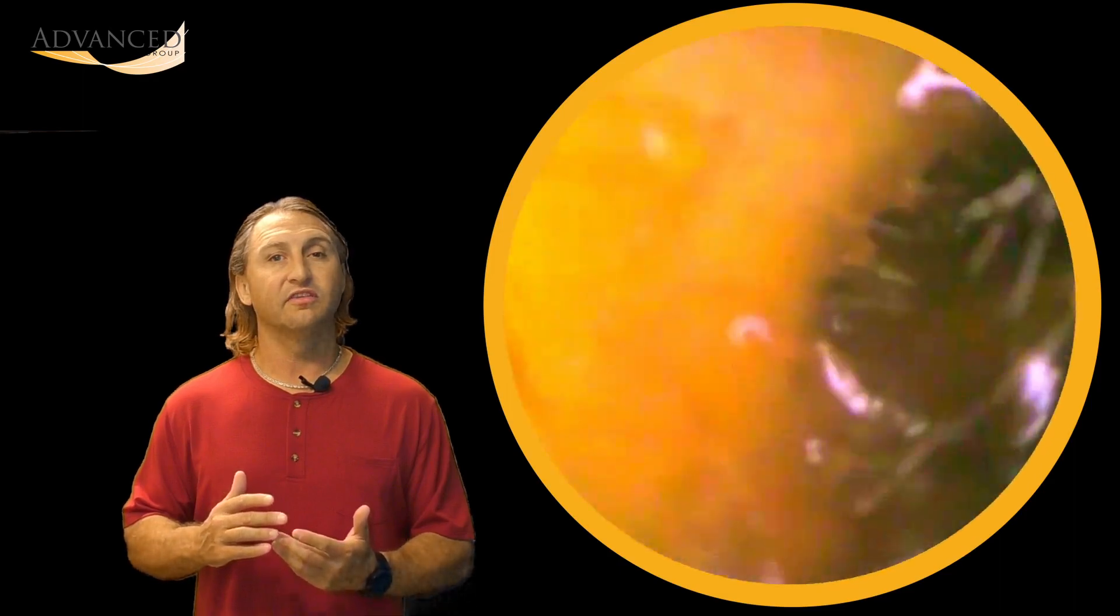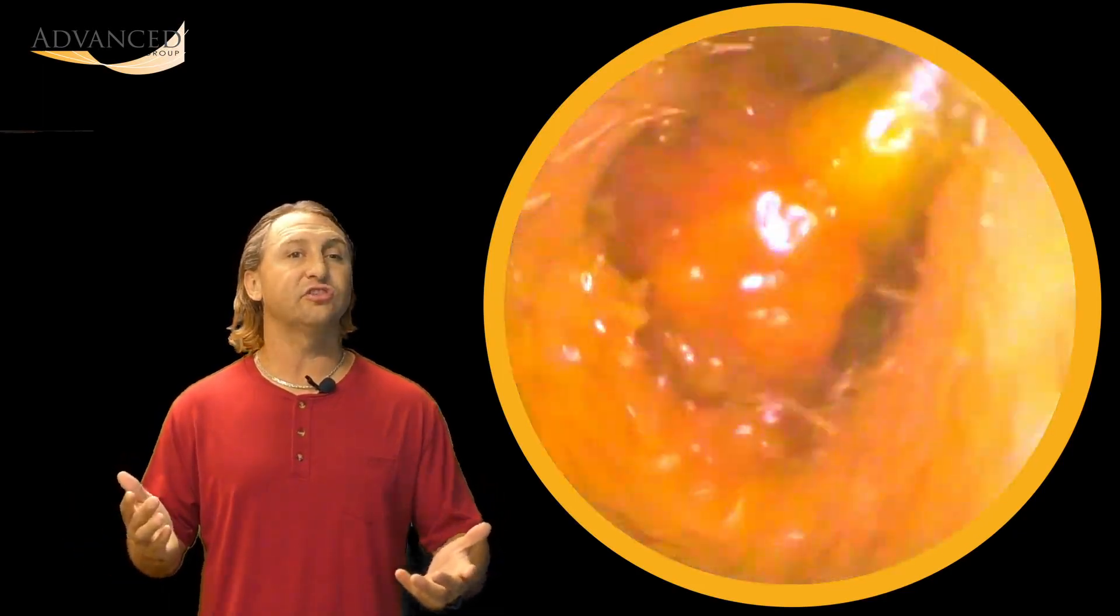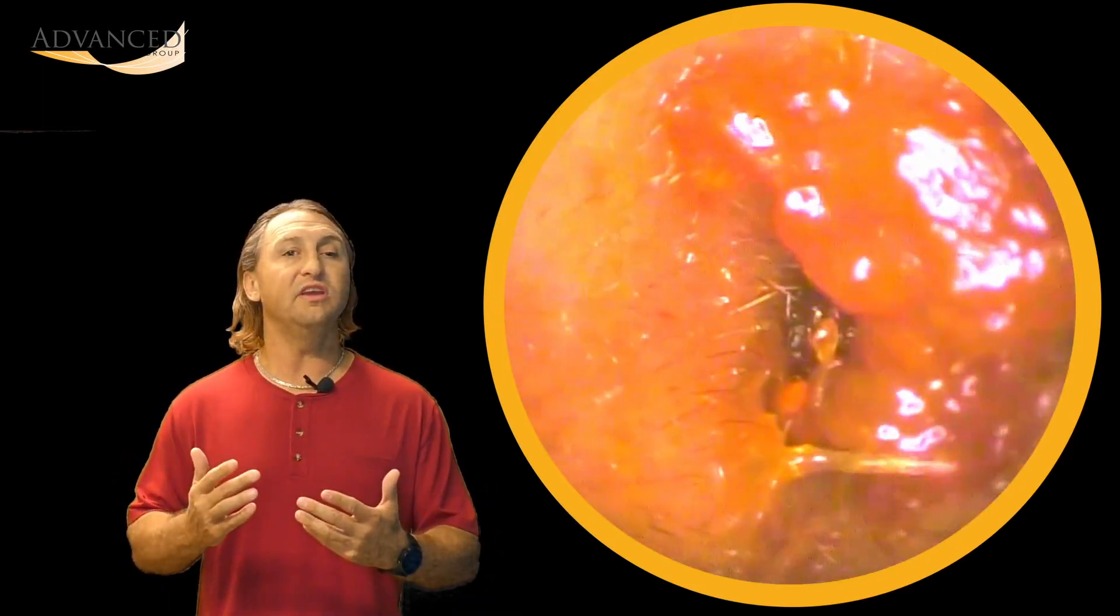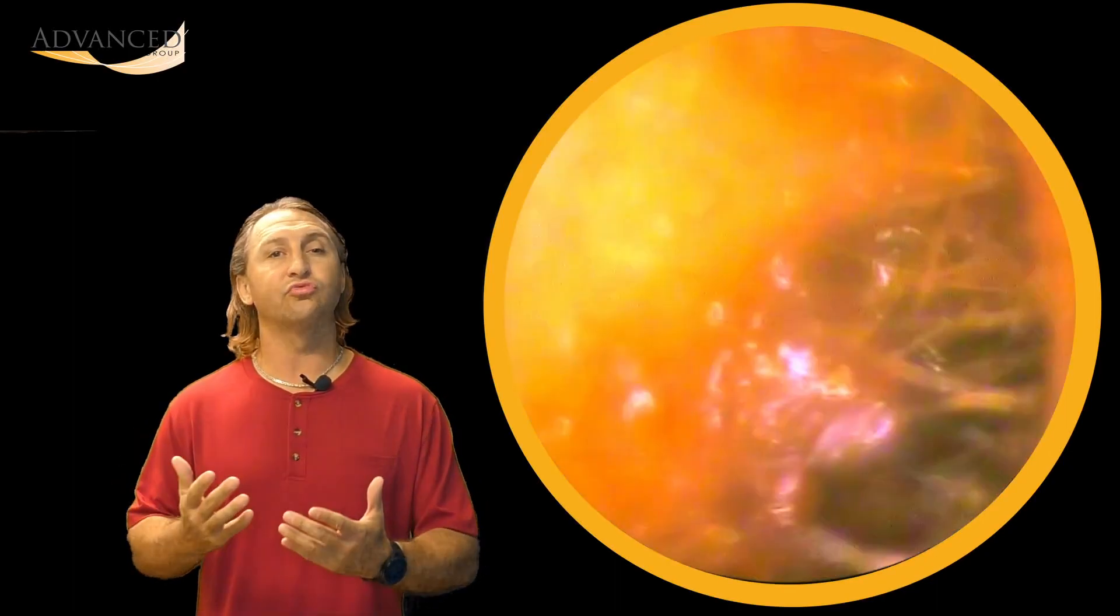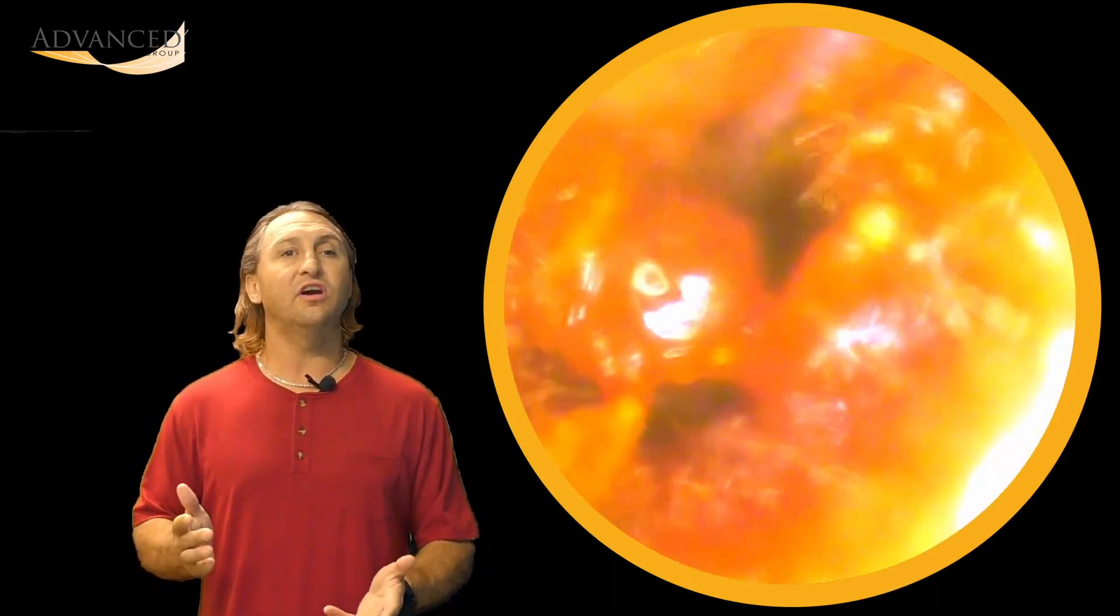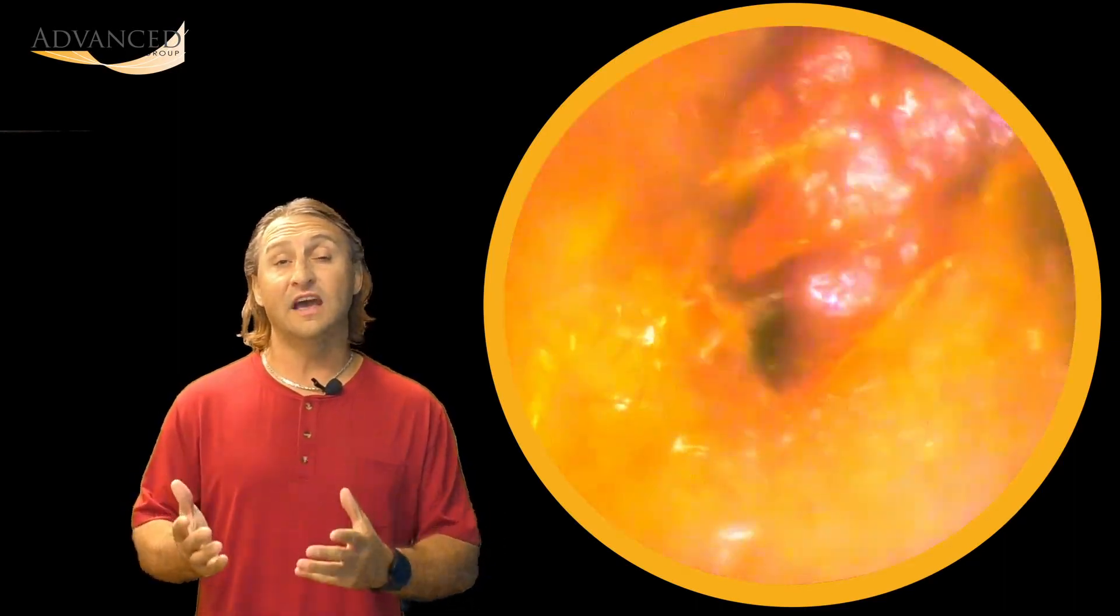We're gonna jump to this patient's other ear. We're trying to show both ears here. Let's see if this one is just as collapsing. You can see it's much more open. The earwax on this side is a completely different color and texture. This one is more gooey, and a more orangish, reddish color. So we're gonna use the curette here, get them all cleaned up, especially since they were suffering from that sudden loss on the opposite side.